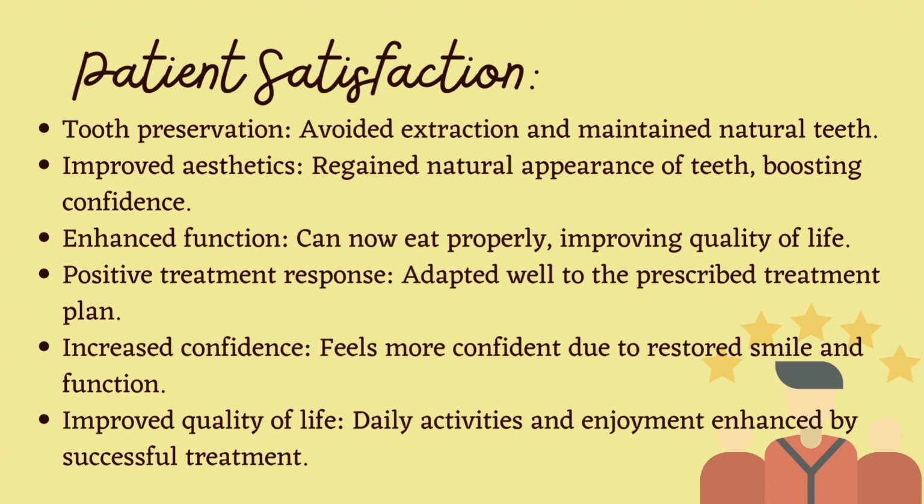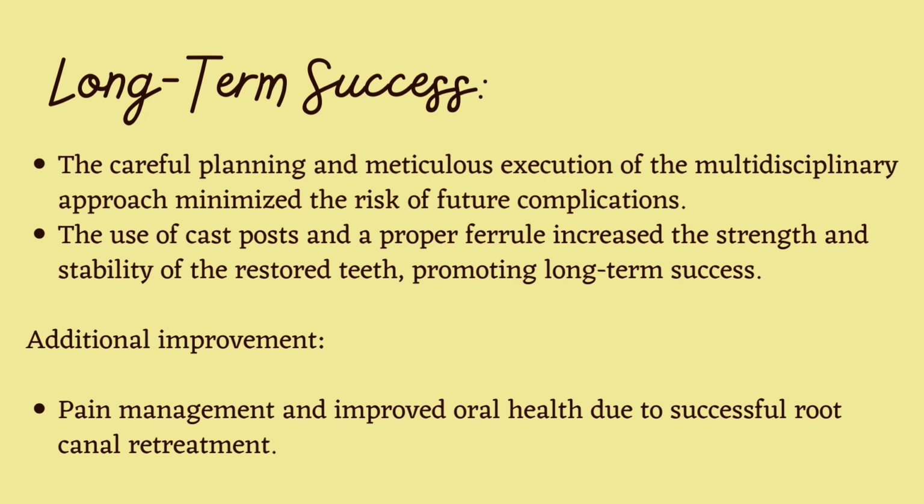Improved quality of life. Daily activities and enjoyment are now enhanced thanks to the successful treatment outcome. Long-term success. The meticulous planning and execution of the multidisciplinary approach minimized the risk of future complications. Additionally, the use of cast posts and a proper ferrule provided extra strength and stability to the restored teeth, promoting long-term success.